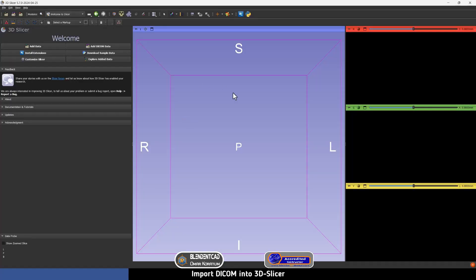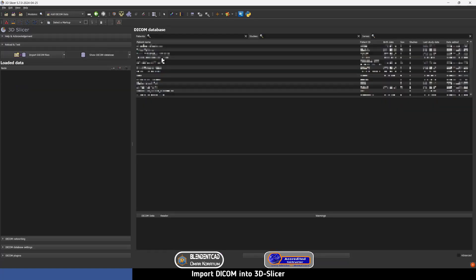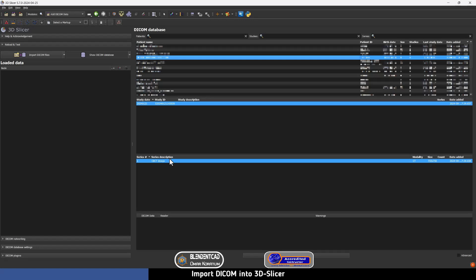Now 3D Slicer has opened. To import your DICOM file, press on this icon. If the patient you are working with has been imported before, it will appear here. But if you are going to import a new radiograph, press Import DICOM Files, go to the folder or DICOM file you are using, and click Import. I have my patient already here, so I'm going to press on the patient's name and then select the CBCT image.